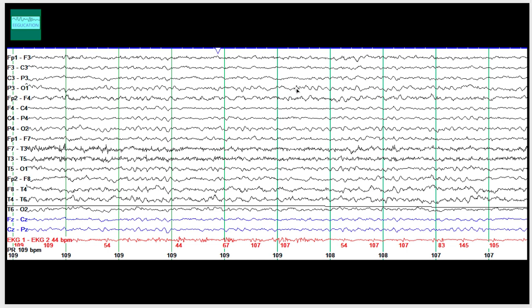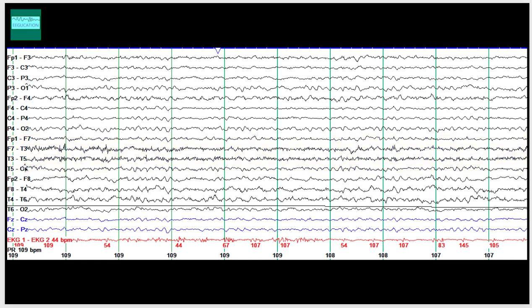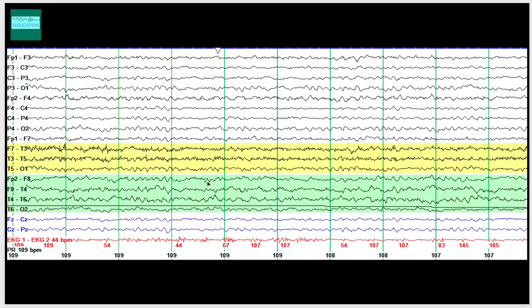In P3O1, you're seeing a lot of theta frequencies and delta frequencies mixed there. If you go back to P4O2, similarly you see some alpha-ish theta to alpha frequency, and then some slower frequencies in the rest of the channel. Comparing the left hemisphere with the right hemisphere, you do see an asymmetry. Looking at the left temporal channels from FP1, F7, all the way to T5O1, and comparing with the even-numbered right temporal channels, the right hemisphere shows more slowing. The EEG background does not demonstrate a well-defined, well-modulated posterior alpha rhythm, and there is relatively more delta and theta frequency.